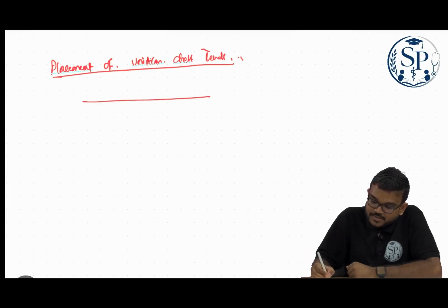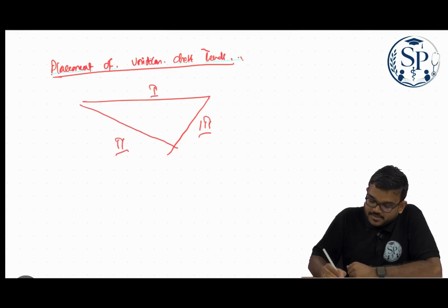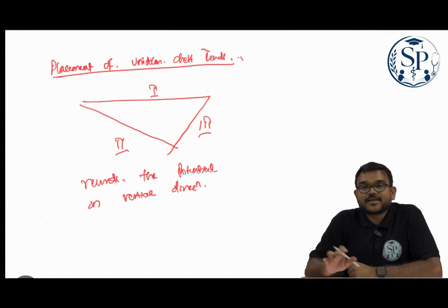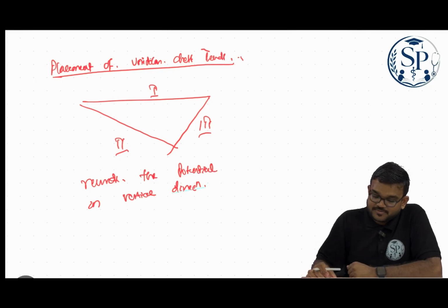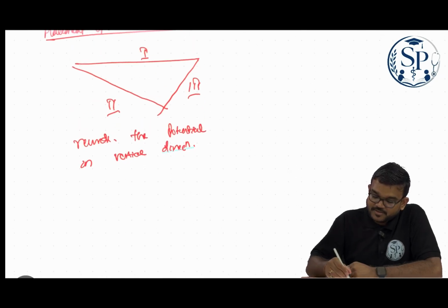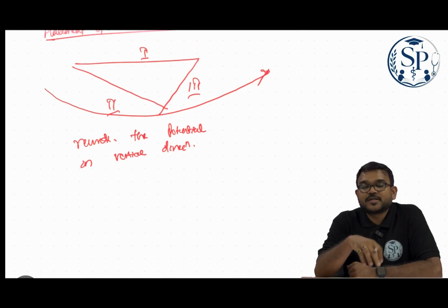Leads 1, 3 and lead 2 record the potential difference across the vertical directions, whereas for the horizontal plane across the chest, some recording should be there.